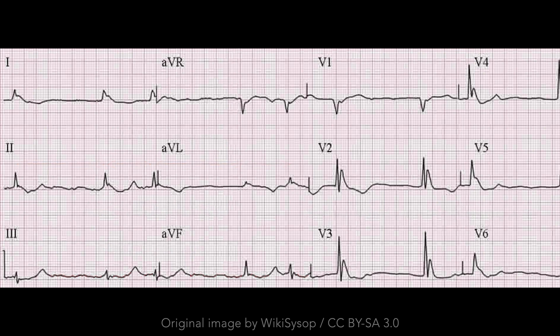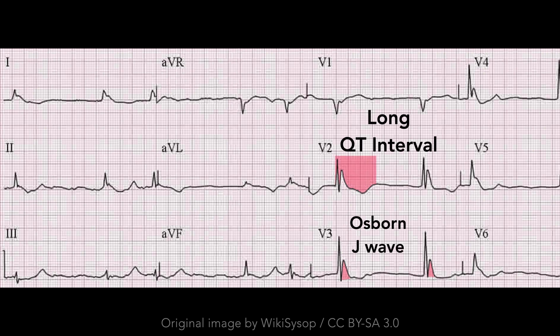In summary, hypothermia can lead to a variety of different ECG manifestations, including J-point elevation, slowed impulse conduction, and bradyarrhythmias. In this ECG specifically, we can make note of the Osborne J-wave, a long QT interval, and atrial fibrillation with a slow ventricular response.